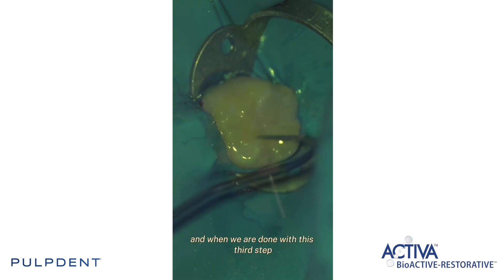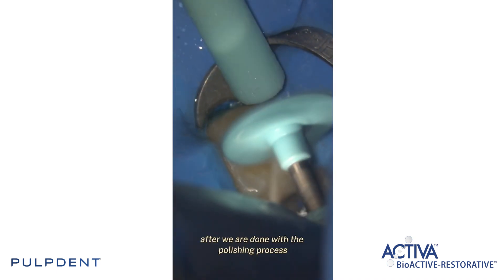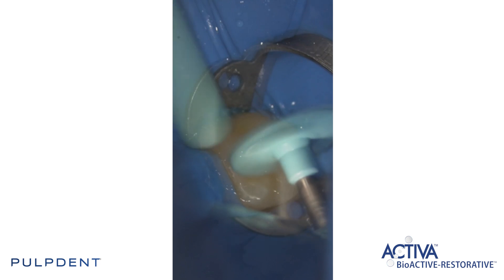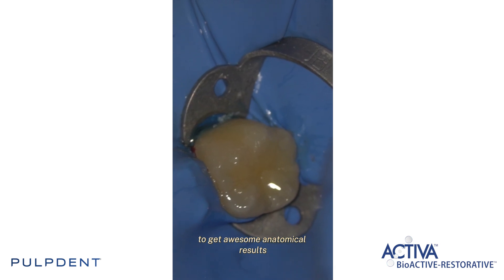And when we are done with this third step we are ready to polish. After we are done with the polishing process I love to apply Seal & Shine from Pulpdent. And this is how I use this beautiful material to get awesome anatomical results.